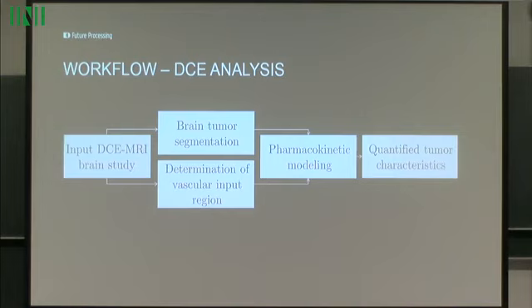After that, we may have modeling of contrast flow in the tissue, and after that we can quantify the curves of the contrast using some numbers that are already established. They are used in the literature, so we know that they actually work. And we can finally build a report that contains all the valuable information that might be used and that hopefully will be used in clinical practice.